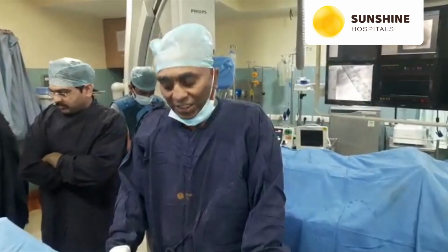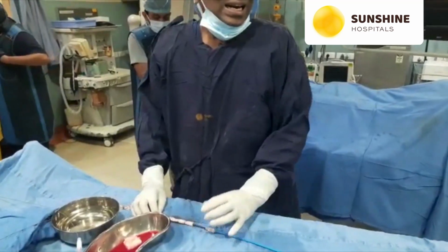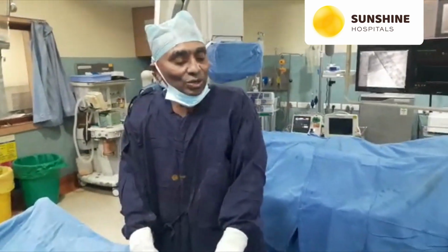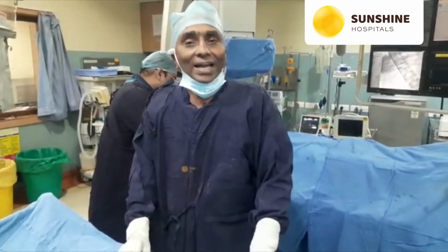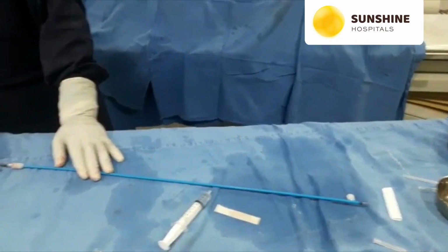Over the sheath we passed the filter retrieval device. We advance the snare and catch the hook of the IVC filter. Afterwards we slowly withdraw the filter into the sheath and slowly withdraw the entire IVC filter. This is the technique. Here the sheath size is 11 French.